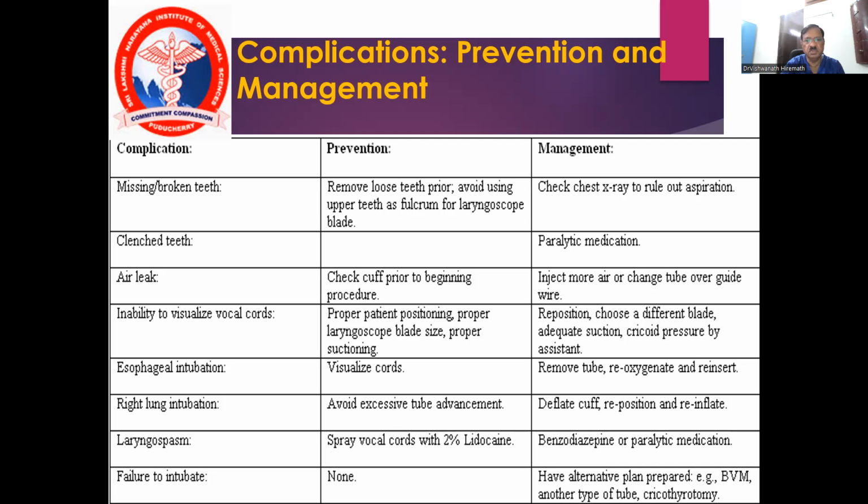Failure to intubate is a problem. So better get the help of an experienced senior, and always carry out the endotracheal intubation with the help of a well-trained assistant.